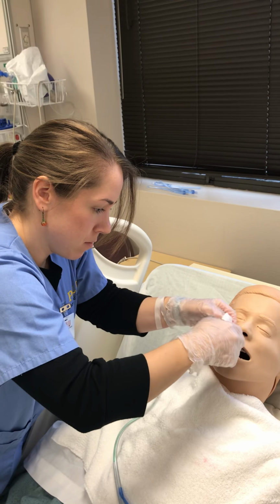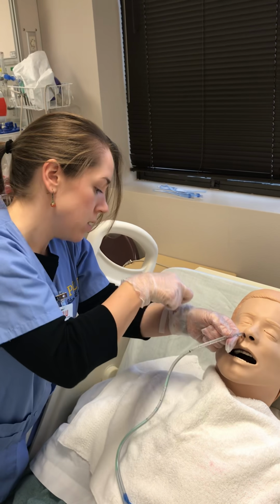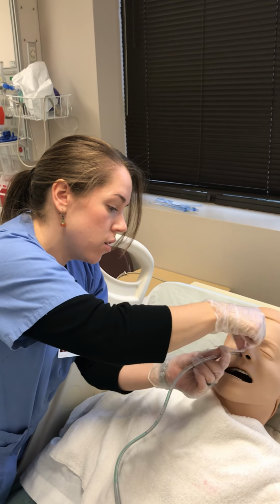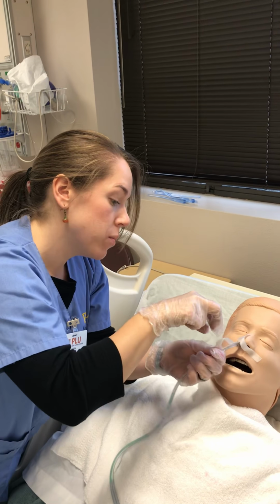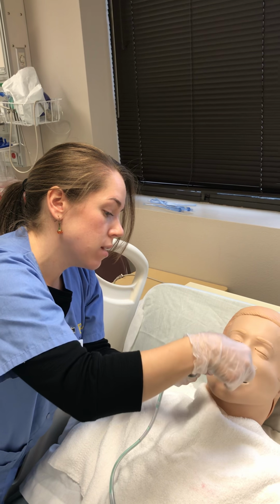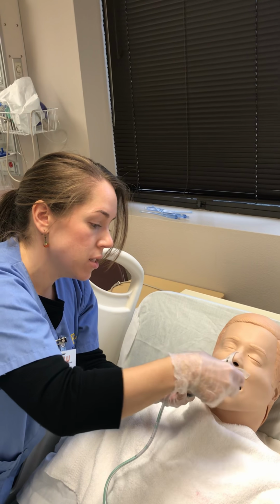My tape is ready, so I'm going to put the end on the nose, and then careful not to get any ripples. I'm just going to do a spiral tape job, going in opposite directions.